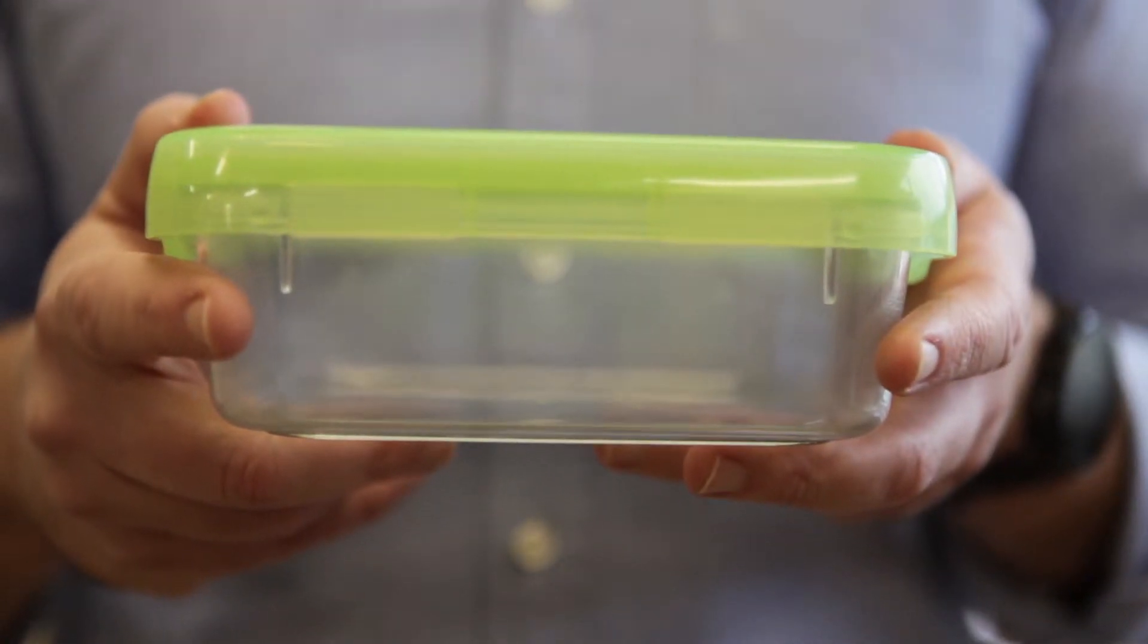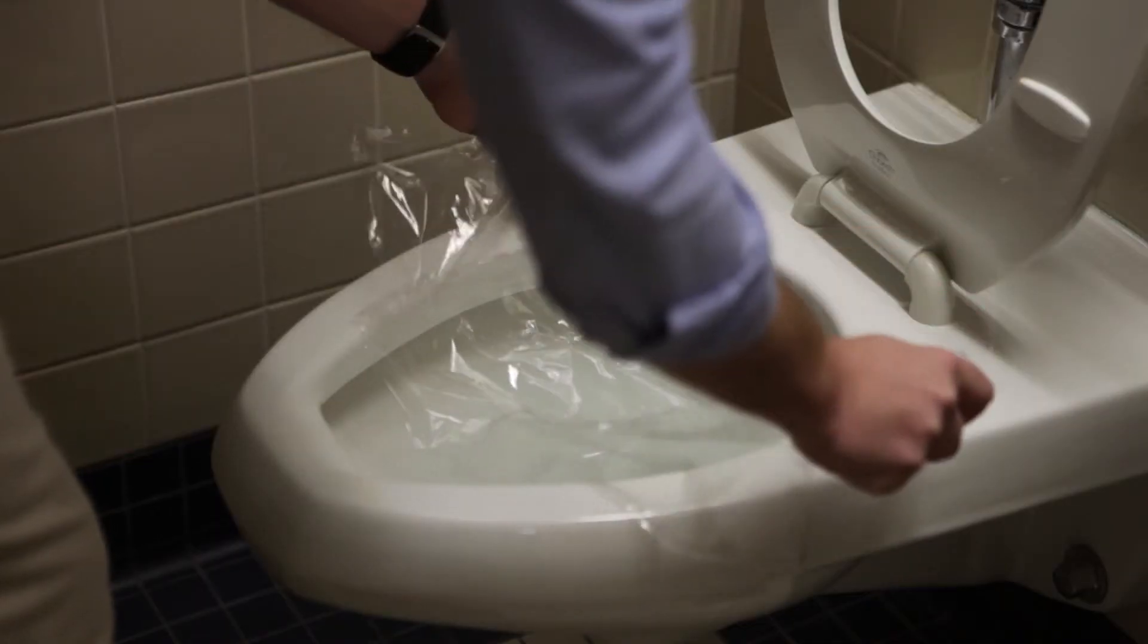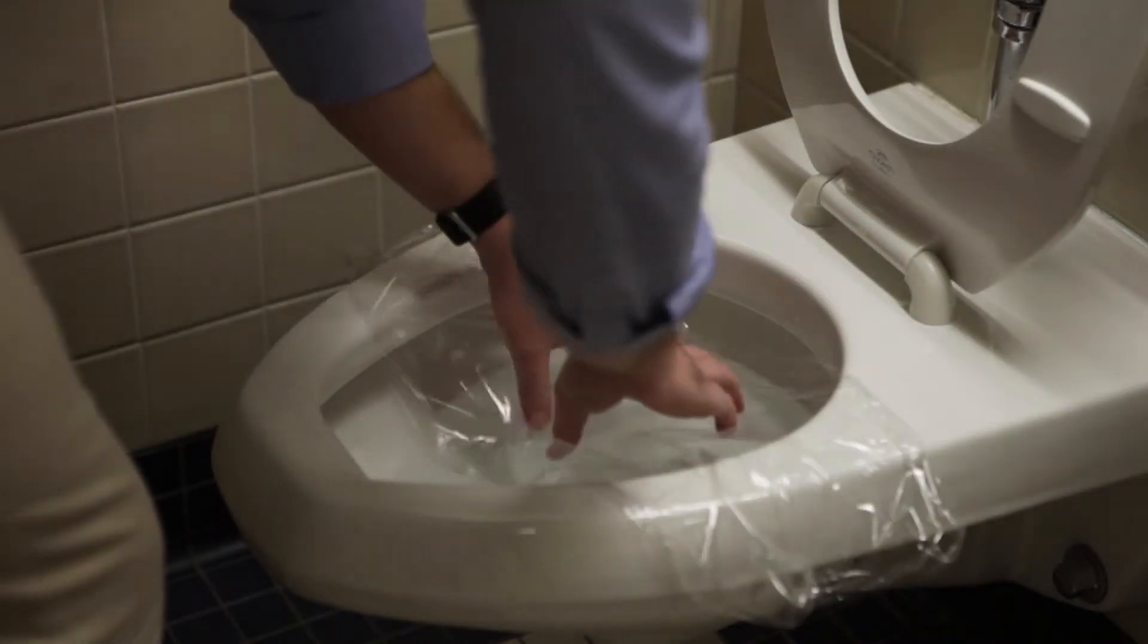There are two easy options for collecting the sample. You can collect your stool in a clean, dry container like this, or you can put a piece of plastic wrap over the toilet.